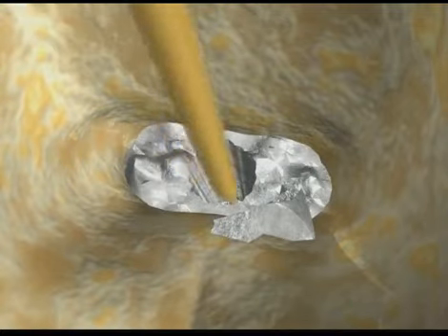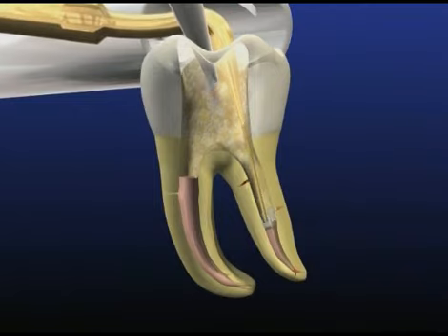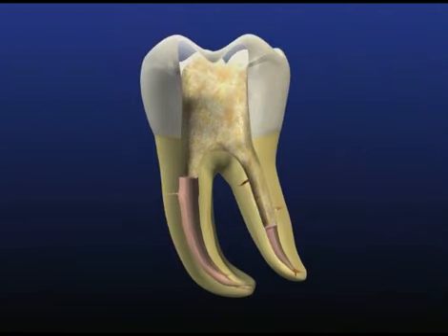Here we see an activated Endo 5 breaking up restorative material and a white MAC tip collimating air to blow out debris. With the elimination of the post, attention can now be directed towards selecting the best gutta-percha removal scheme.